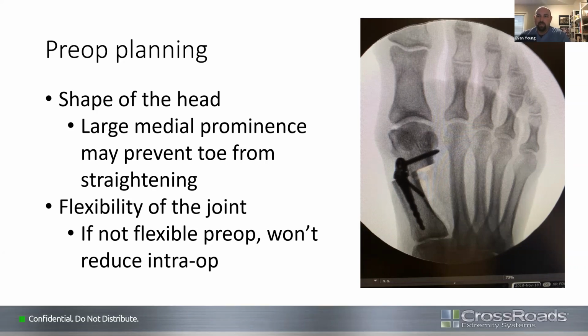So a lot of times I'll get an axial sesamoid view preoperatively. That's pretty much my standard bunion: AP, lateral, and an axial sesamoid, just to get a good look at where the sesamoids are, make sure that they're still on either side of the crista and that there's not significant blunting of the crista or something like that that's going to possibly create a problem.